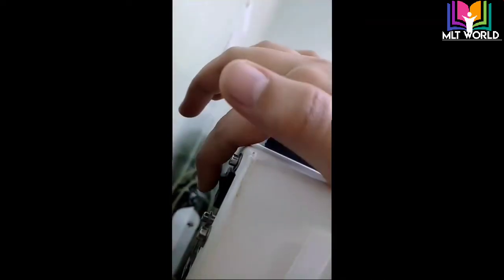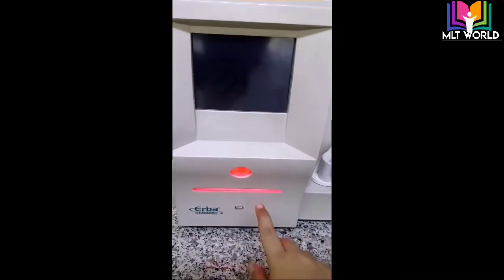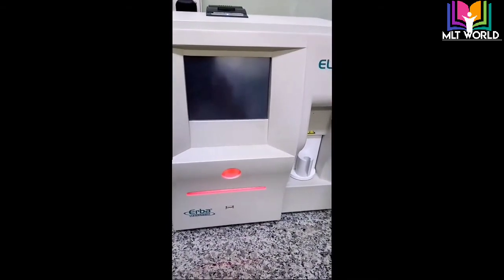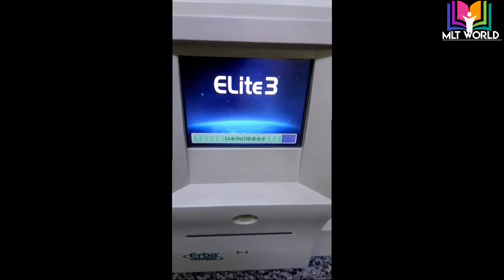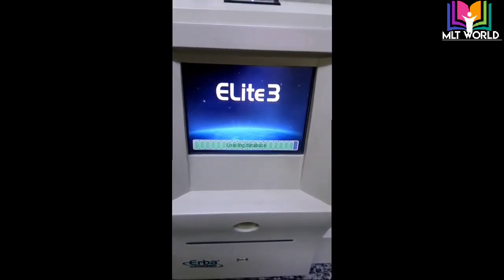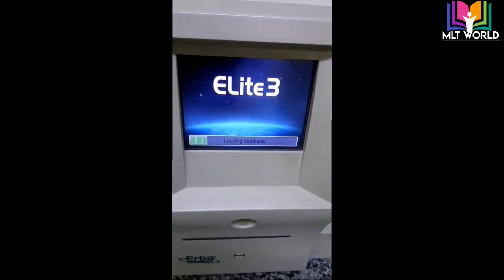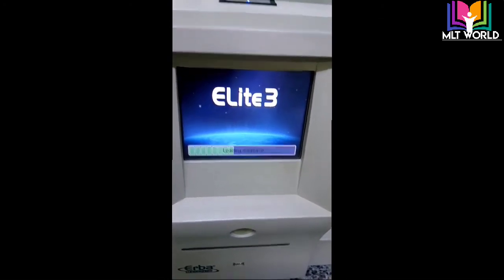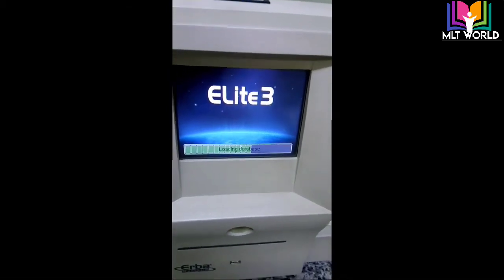On the back side there is a switch-on button. I will switch on this machine now. You will see the light blink as it powers on. It will load all the data and information about calibration and reagents. After loading, it will go to the main screen.